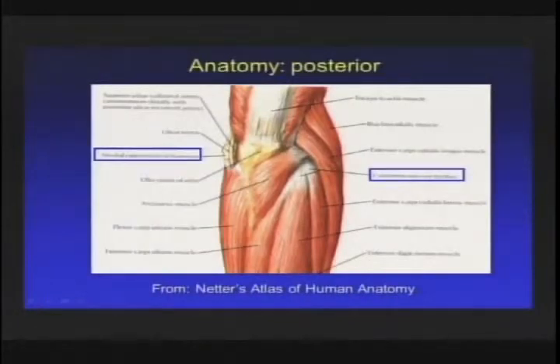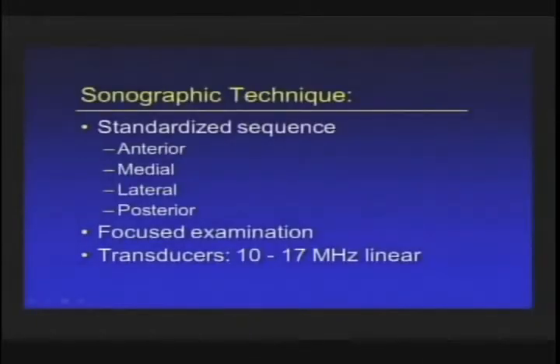Now if we look posterior, remember that I connected the lines, the dots between the medial epicondyle and olecranon process. This is where we see the ulnar nerve. What I want to point out with this drawing is this is the enclosed space between the two heads of the flexor carpi ulnaris, or the true cubital tunnel. But because entrapment will cause swelling proximal, we tend to measure things up here where it's maximally swollen, but the true tunnel, the cubital tunnel, is where this traverses between the two heads of this muscle tendon.